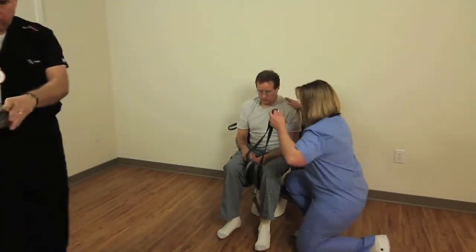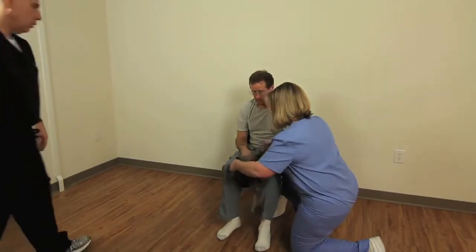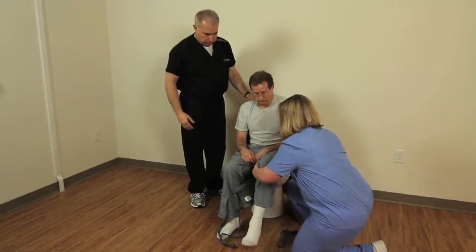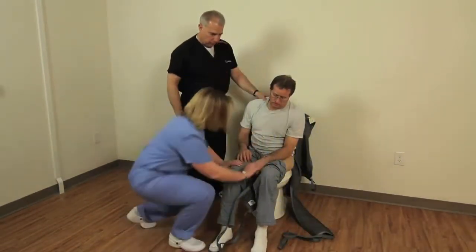Stand in front of the patient, bend down to a sitting position and slightly lift the patient's foot and place it on your knee or thigh to reduce the pressure on the sling loop. Next, fold each leg loop underneath itself.